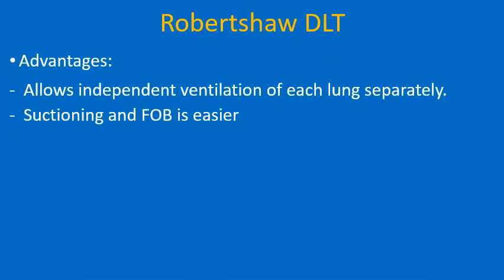Now coming to what are the advantages of Robertshaw double lumen tube. The advantages are: it allows independent ventilation of each lung separately, and suctioning and fiberoptic bronchoscopy are also easier. And even the resistance which is offered by the tube is less when compared to previous older tubes.